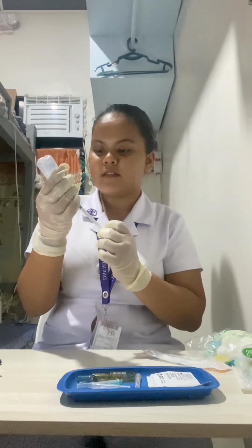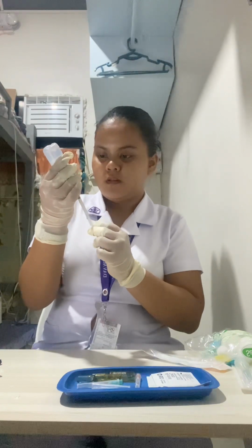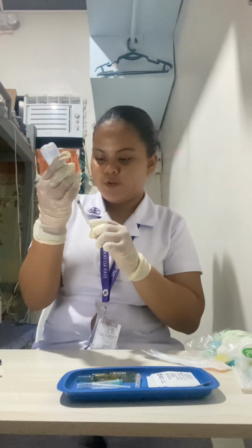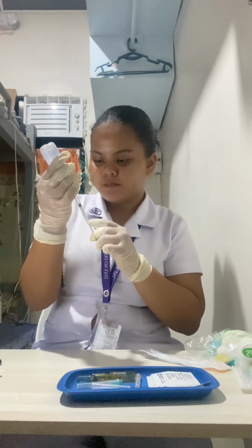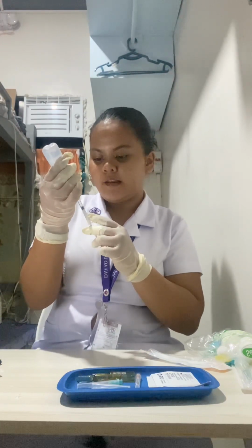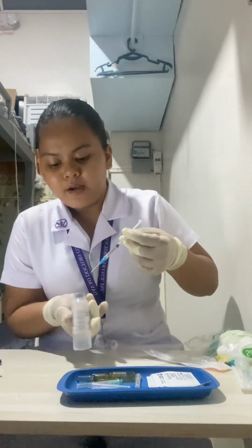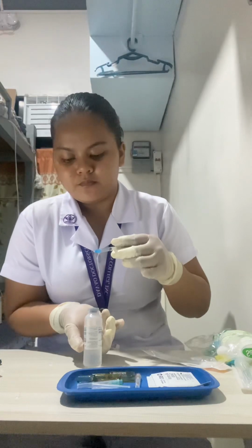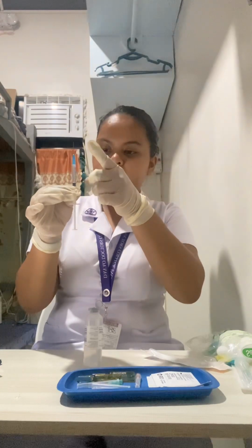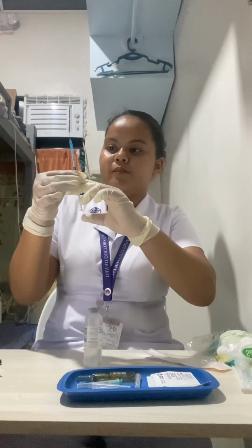So this is the second method, and slowly, gradually we're going to withdraw the medication that is prescribed, which is 0.5 ml of medication. You have to make sure that it is at eye level, so that you can determine that the correct dosage is being withdrawn. As I said, if necessary, we can tap or flick the syringe so that air is ejected.